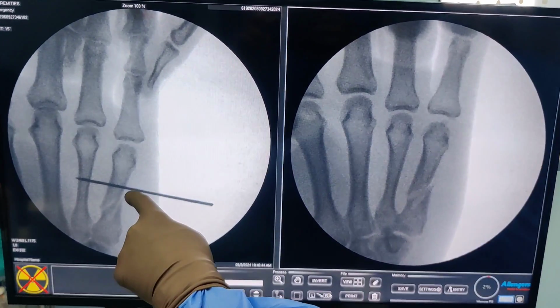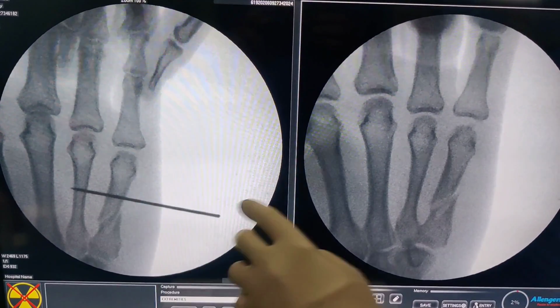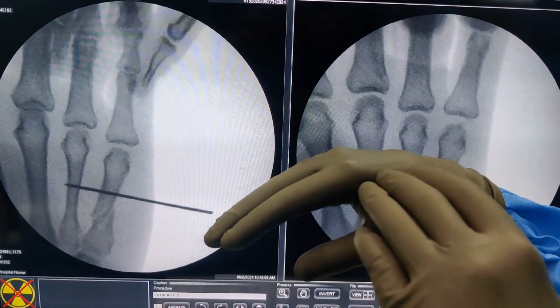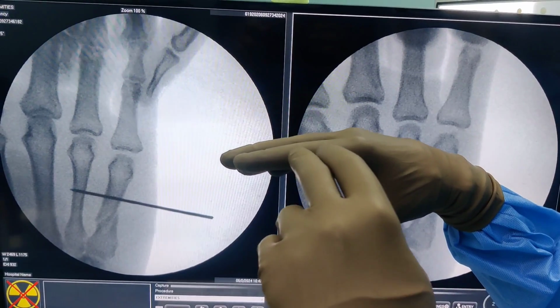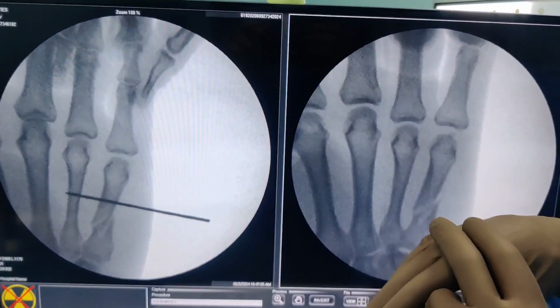So I'm just slightly distal to the fracture site. I was in the bone and you could see that I was going through the bone. Then you will feel a giveaway and then you will catch the fourth metacarpal. But the key is to angle it slightly down because this is slightly more dorsal. If you go like this, you might miss it. So just slightly down and then pass it, and then you'll be fine.